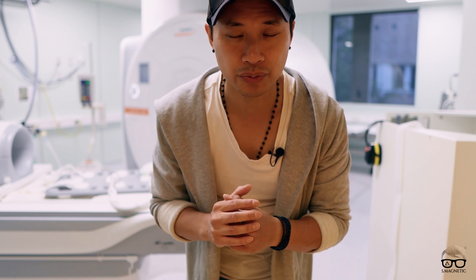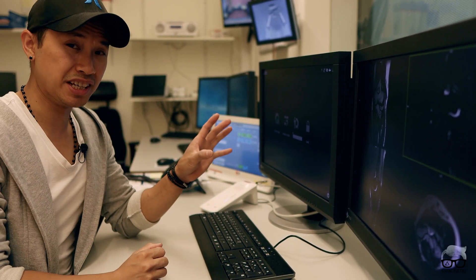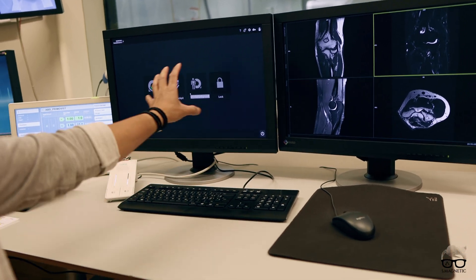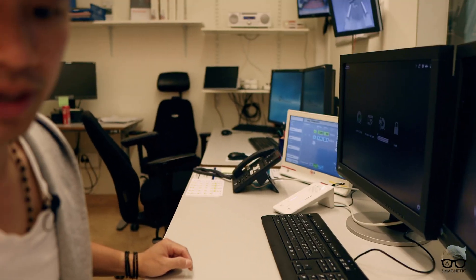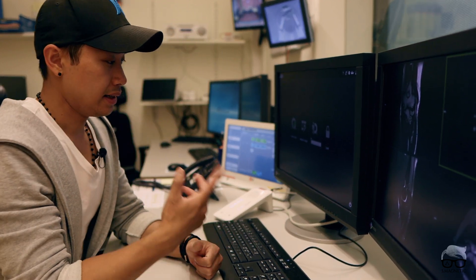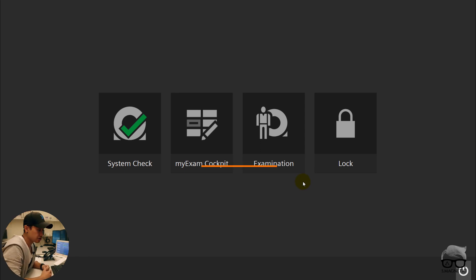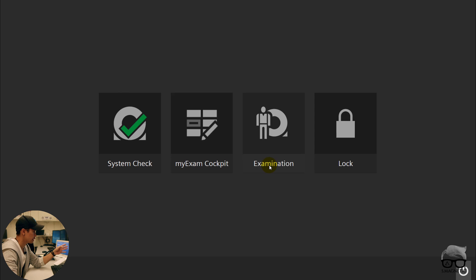Well, that's it for the coils — we have more coils but due to time I want to show you a little bit of the software. Let's check the software. In front of me I have two big screens. These are extremely big — it's a big jump going from the old software to the new. In front of you here you can see the software: you have System Check, My Exam Cockpit, Examination, Lock, and Turn Off the Scanner.